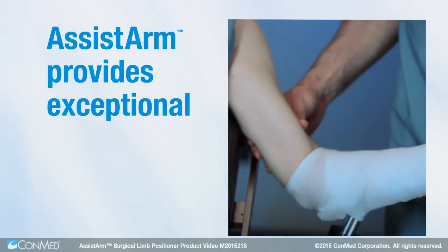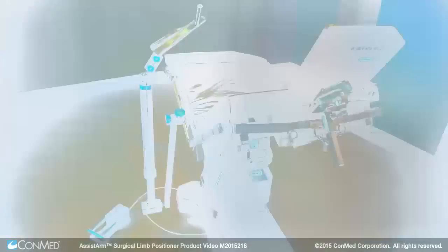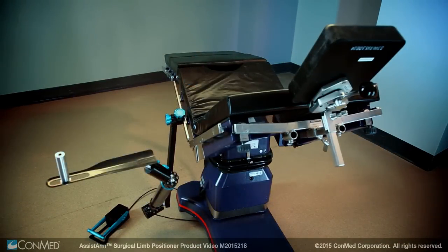Assist Arm provides exceptional control, while the pedal-operated fail-safe locking system steadily maintains the limb in position without obstructing the surgeon's workspace.